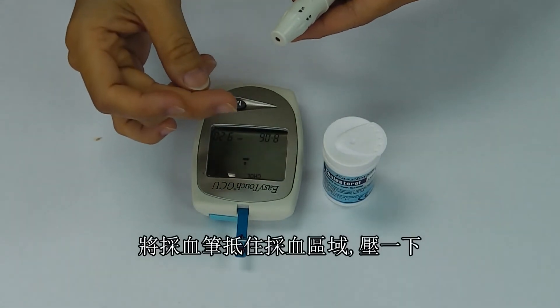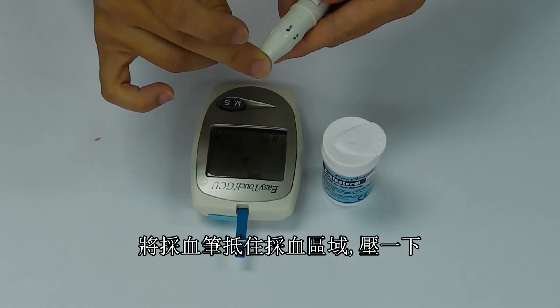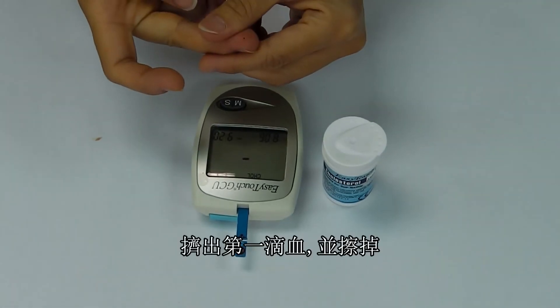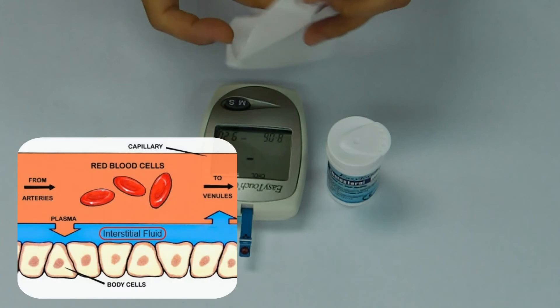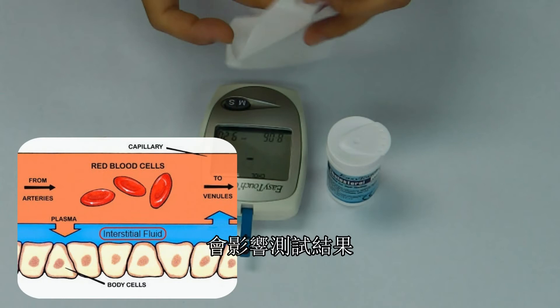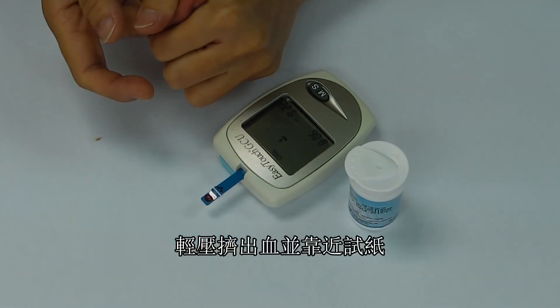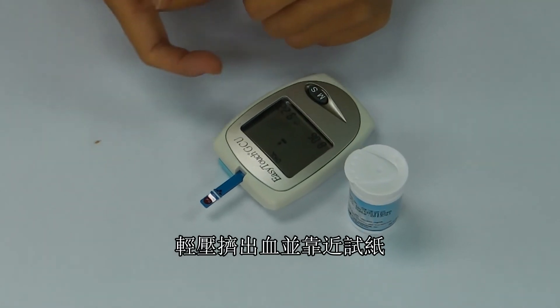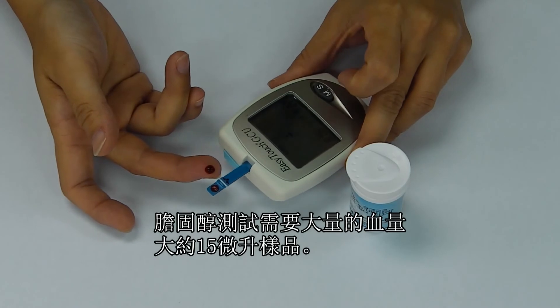Place the tip of the lancing device on the lancing site and press the trigger. Squeeze out a small sample and wipe it away with a clean tissue. This first drop contains interstitial fluid, which significantly affects the results and should not be used for testing. With moderate pressure, squeeze out a second drop large enough to perform the test. The cholesterol test requires a substantial 15 microlitre drop of blood.